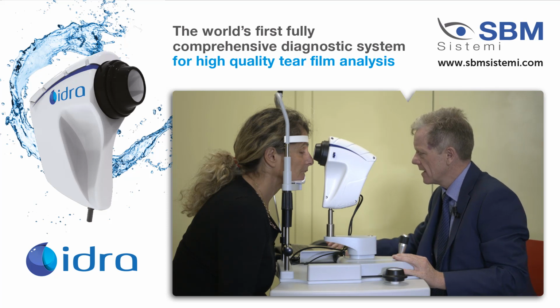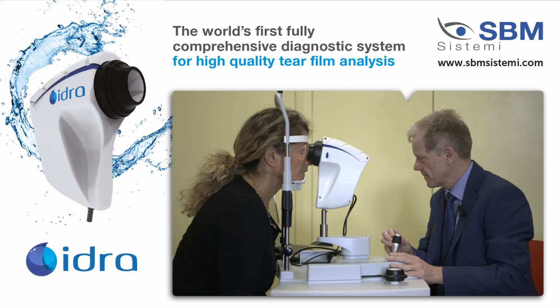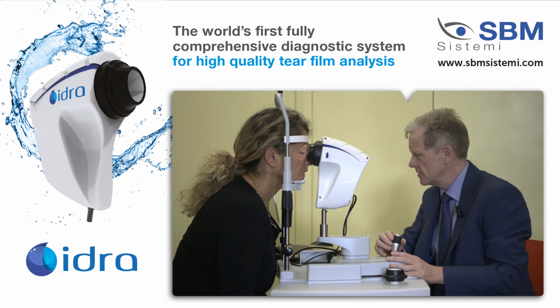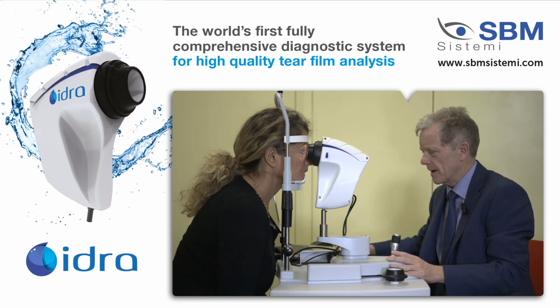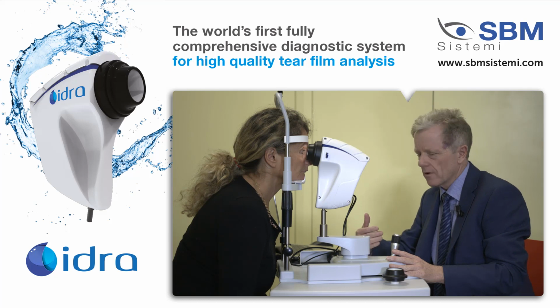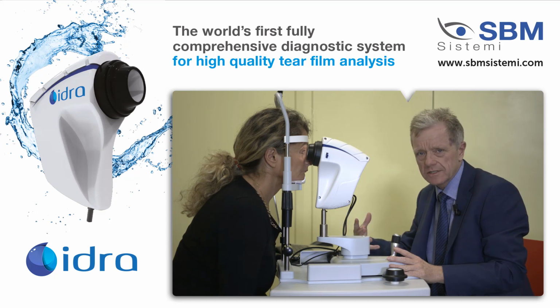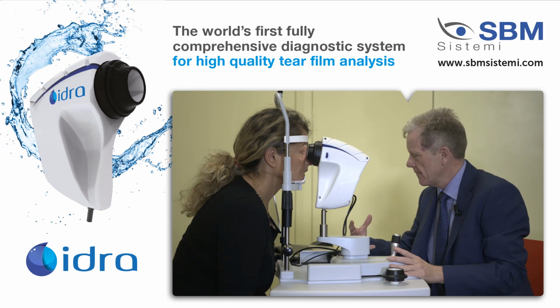So here we have a laptop that just allows us to focus. And here I have the Placido disc looking at that quality of the tears, and we can see breakup time. Simply, I start a video, and the video itself will record the blinks and the breakup of the tear film during the course of a normal blink routine. So no instructions to the patient, just a normal blink, and then just analyzing that tear surface.